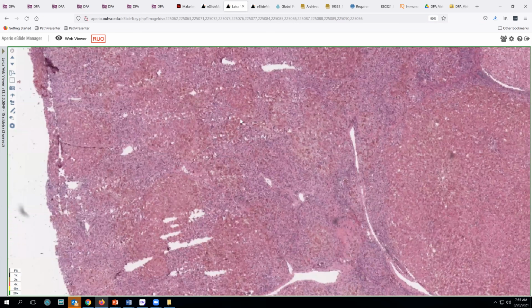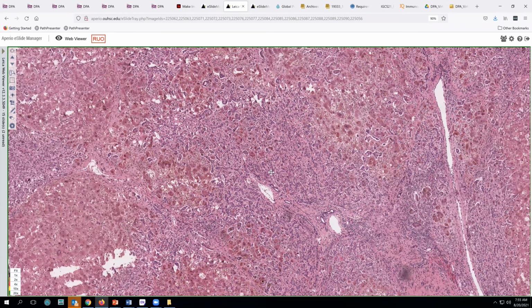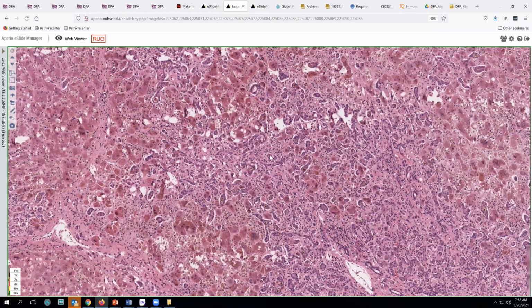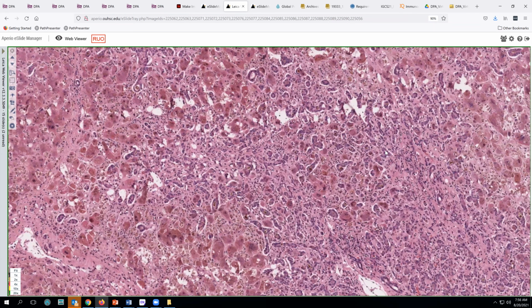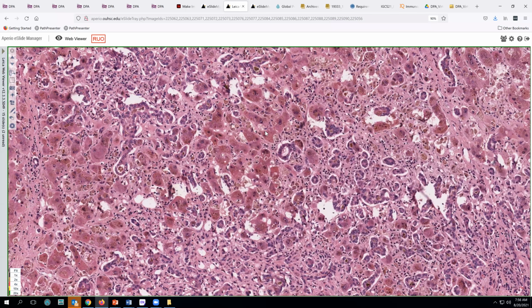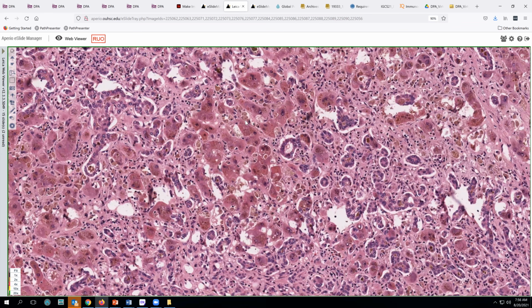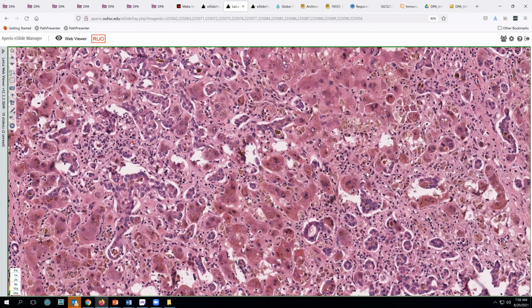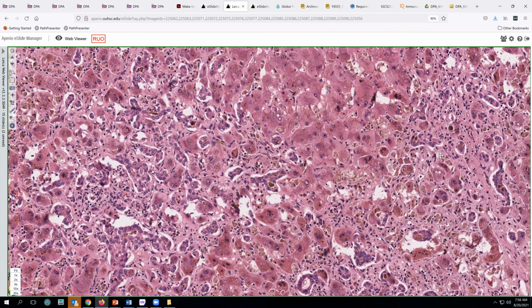So let's look here at these micronodular areas first, where most of what we have is just fibrosis. And we see a lot of bile duct proliferation here. And that's what all of these small racemose glandular areas are. And we see these sort of dying or distressed hepatocytes with varying degrees of pleomorphism to the nuclei, loss of surrounding relationships one with another. We're not seeing a lot of fat or lipid here, but we do see a lot of pigment.